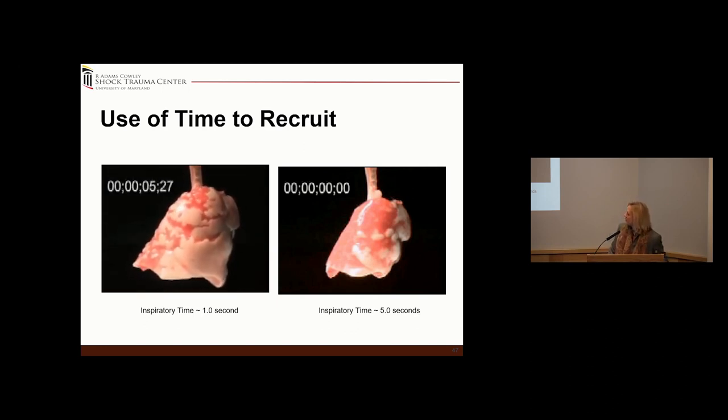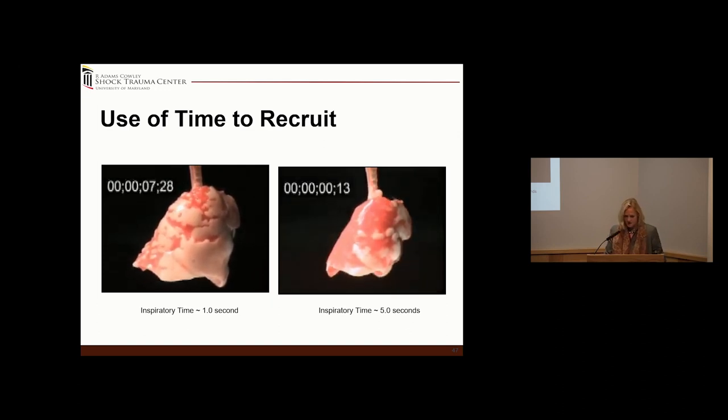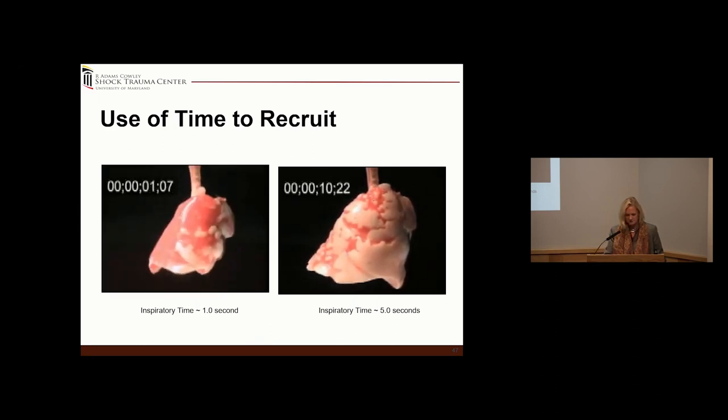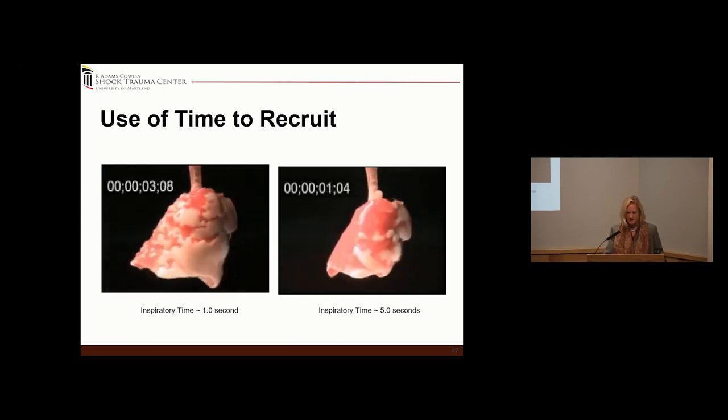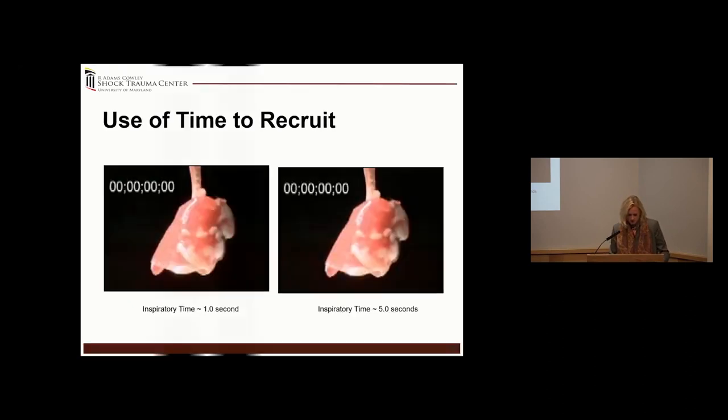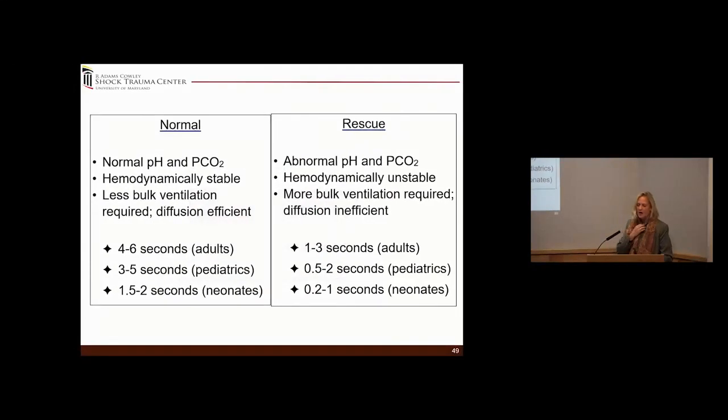Oh, well, it went all the way. Maybe it's flipped. And, oh, it just didn't stop. So, at 1 second, there's just hardly any recruitment at all. Right there. There we go. So how do we set our T-high?